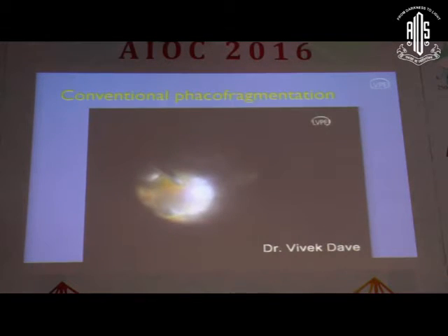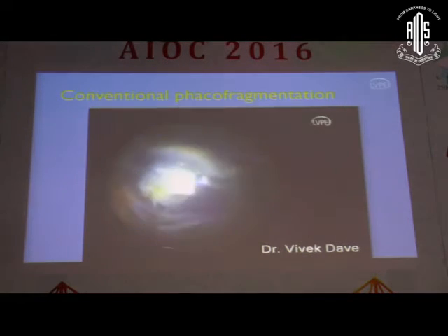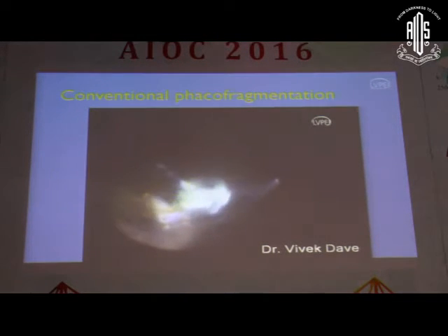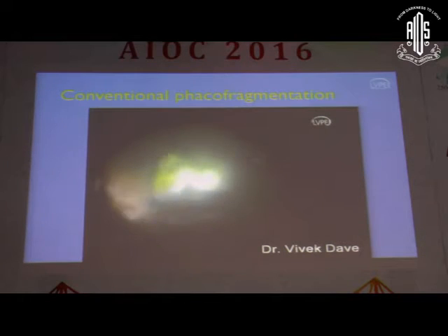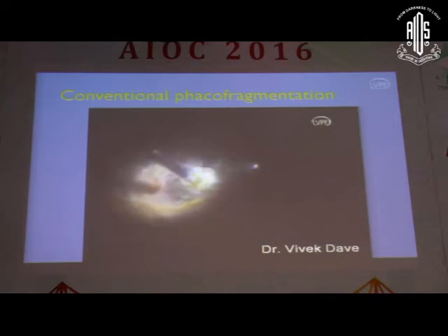just cut off the entire nucleus pieces and aspirate in the mid-vitreous cavity. This is a case of conventional phaco-fragmentation where the lens has fallen down after a previous retina surgery. It's a vitrectomized eye. So with a phaco-fragmentome, which is just like a normal phaco needle, the nucleus is impaled, brought into the mid-vitreous cavity, and using the endoilluminator as a second instrument, it is slowly fed into the phaco needle and the entire nucleus is emulsified. So this would be the conventional phaco-fragmentation technique. Pieces are slowly fed into the fragmentome and the pieces are emulsified.